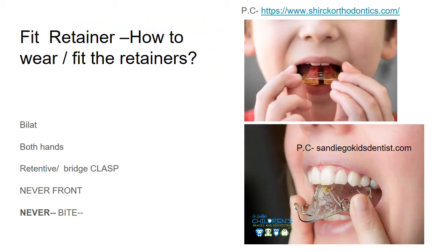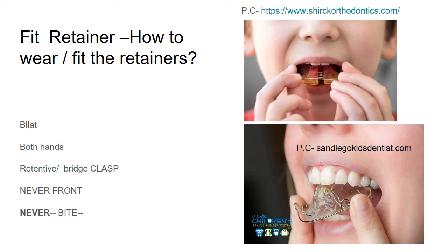The first and foremost instruction is how to wear the retainer. Use both hands — the thumb and index finger on each side — to hold the bridge of the Adams clasp or whichever clasp is used. Position it bilaterally into the mouth and then press it upwards. A common mistake is that patients position the retainer by holding the front wire, the labial wire.